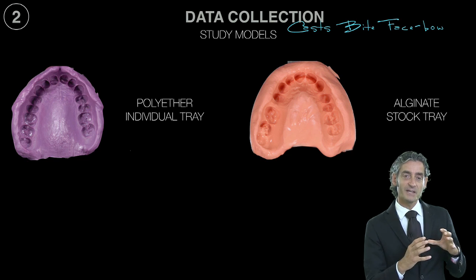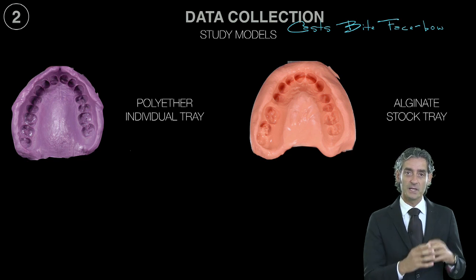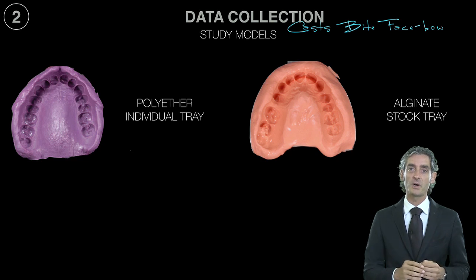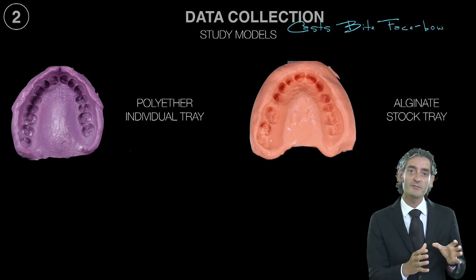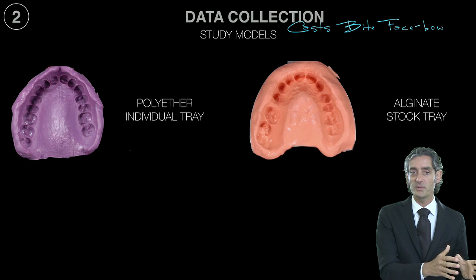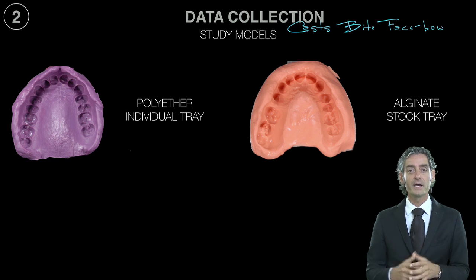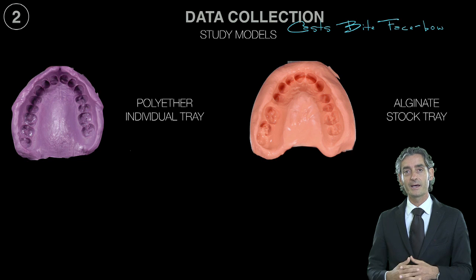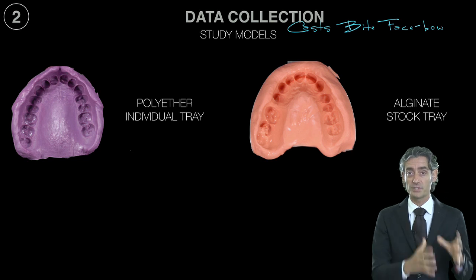And then the casts that we will obtain are to be kept in our office, just to prove the start of our therapy, just to have an idea, so we don't have to use this. We can make a copy of this cast, and then if we have to do a provisional restoration, we can use this copy, not the original one.